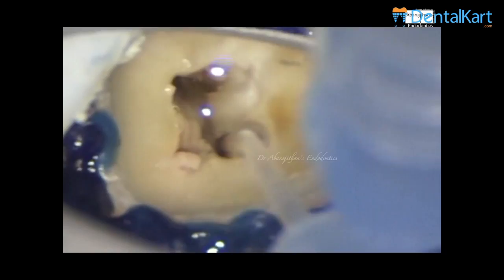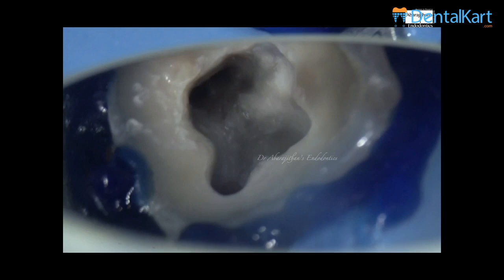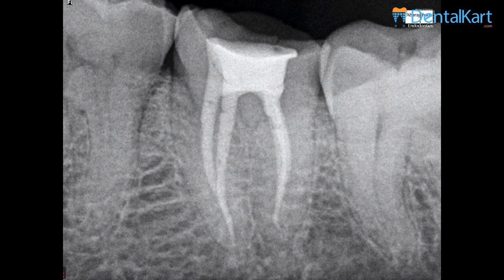After debriding the canals well, you can see nice clean canals and the pulp chamber beautifully cleaned. The same 20/06 GP is going to be used here as well — this is the master cone. In mandibular second molars we need to be really careful with length control because the mandibular canal may be very close to the periapical region — we cannot overshoot. With a controlled obturation technique we made sure nothing went beyond. You can see that though this is not a highly curved canal, it is a tough tooth. For a file being used for the third time without fracture, you can see the multi-planar curve with a nice acute curve in the distal canal.